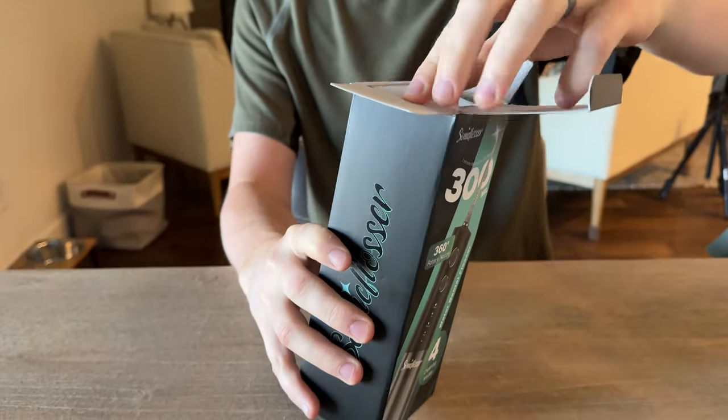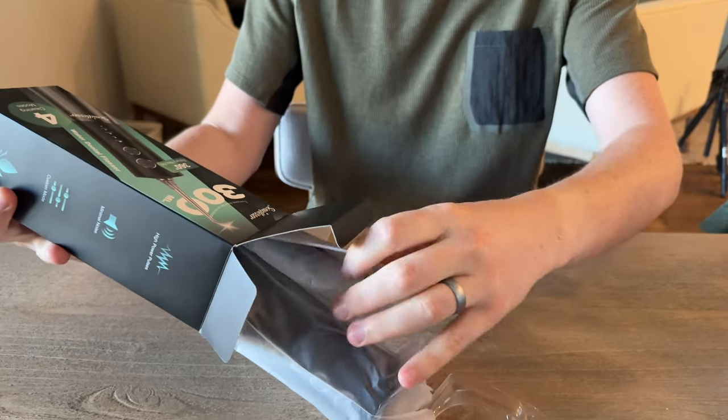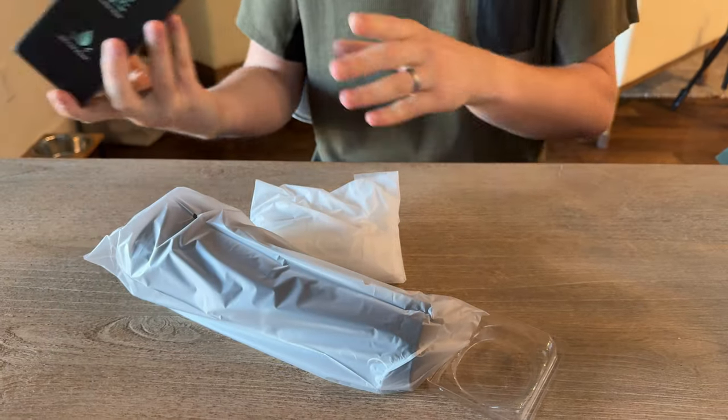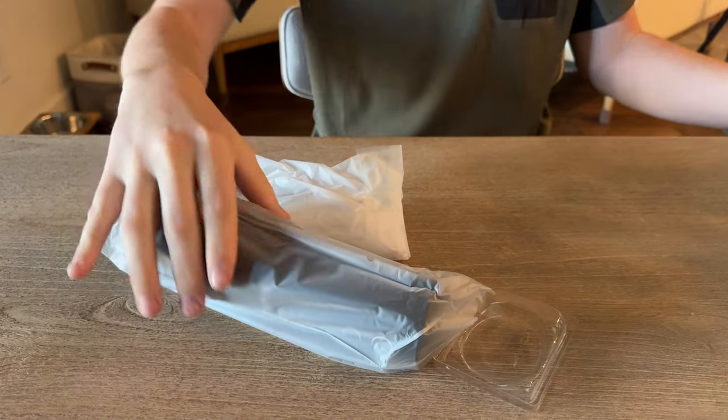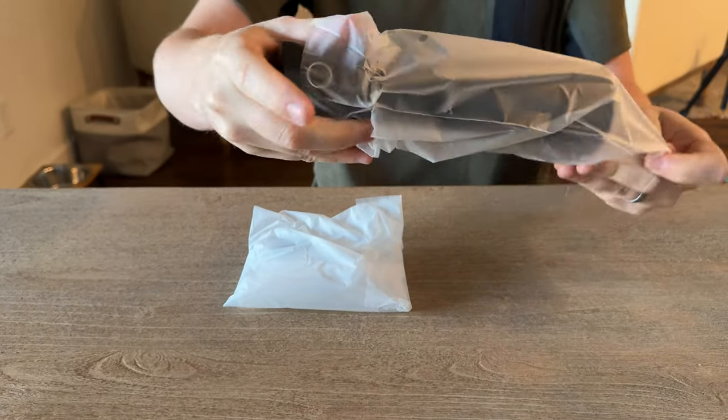Pop the lid off here and then just pull it out. Some instructions come in the box, along with a couple of plastic pieces. Here's the flosser itself.